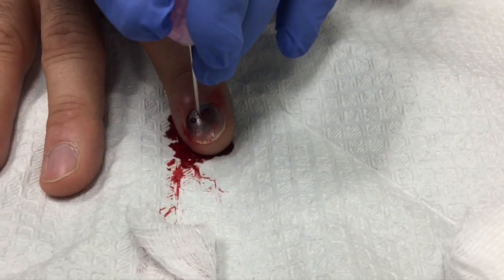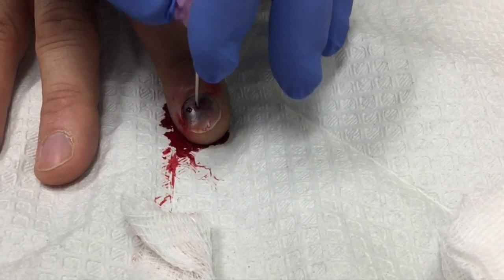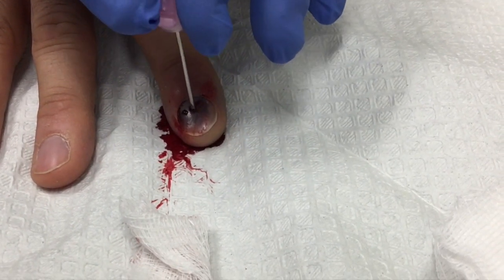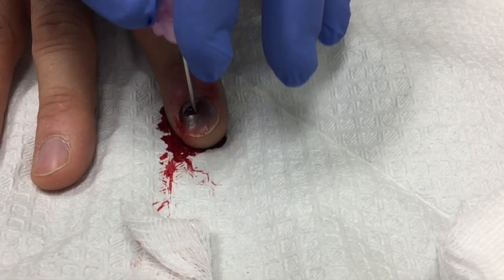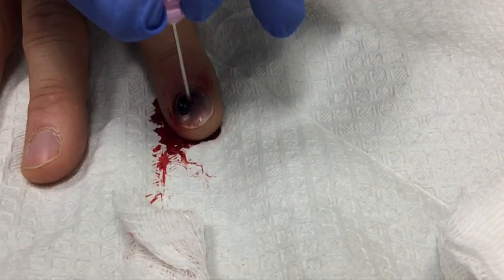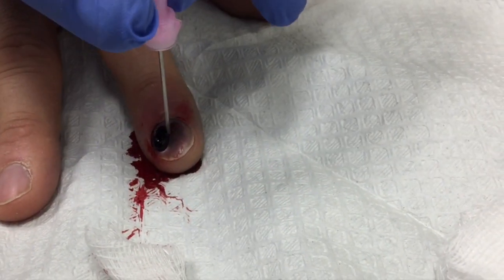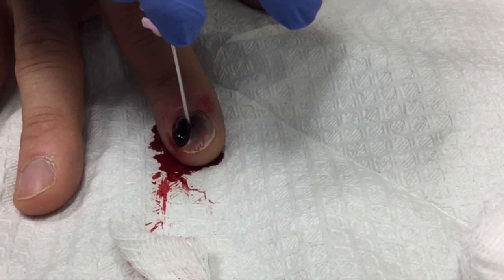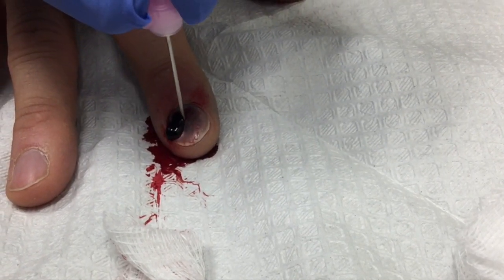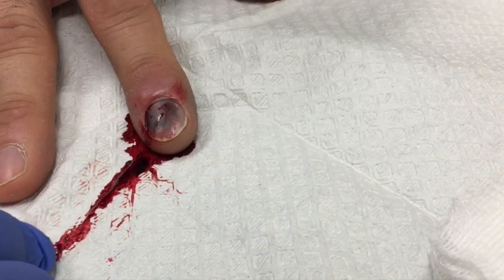We're almost done, this will be the last one. You got a lot on that first one — I don't know if you feel any better or if you're still saying ow from the second poke. You can see it — just a drop of blood under this nail, right? I'm putting very light downward pressure, don't want to get your skin. But I think we're good there. All right.